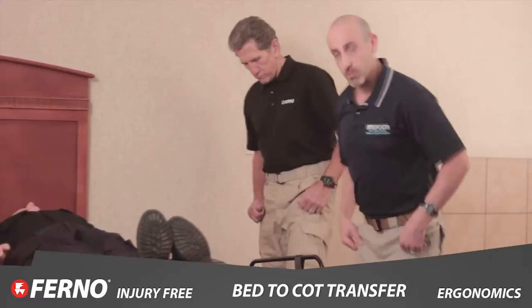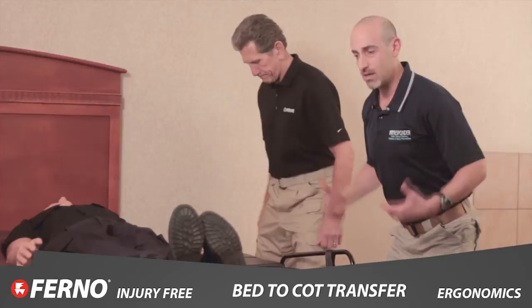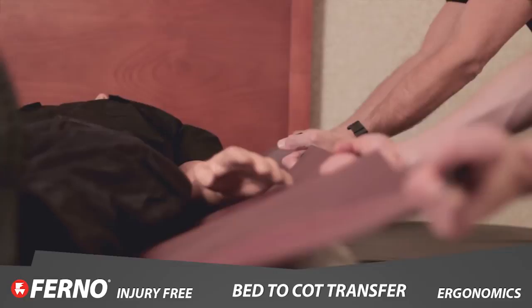All we're going to do is get into what we would refer to as a linebacker stance — hips down, feet nice and wide. Another way to think of it is an athletic stance. As always, head up, shoulders back. We can grab hold of our friction-reducing device and everything's stable.